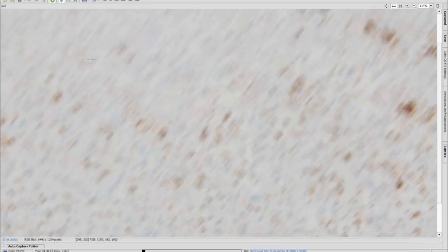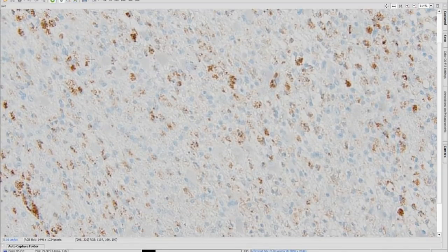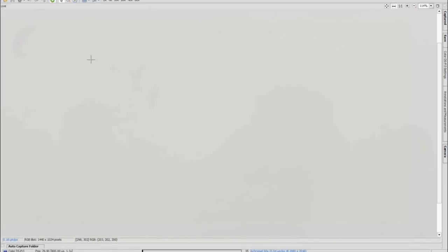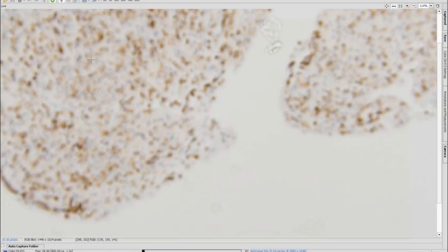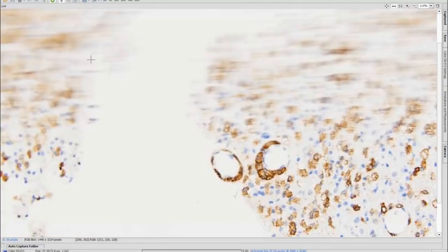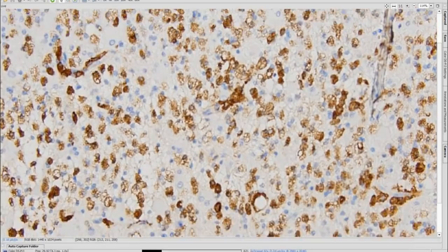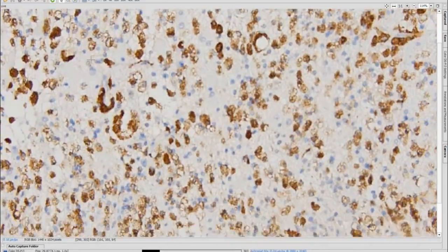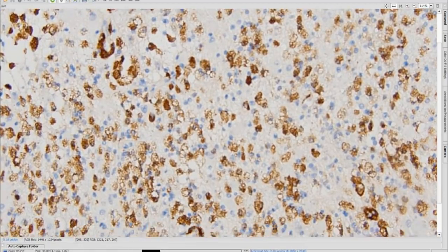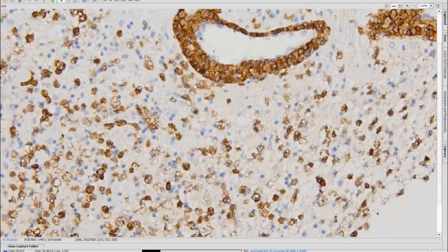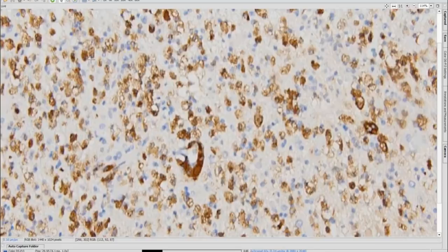You can see accentuation of CD68 around perivascular areas and also diffuse infiltration of other areas. CD68 is not 100% specific — it's a marker of lysosomes — so sometimes tumors with increased lysosome content, including gliomas, can be CD68 positive. A more specific macrophage stain is CD163, which we have here. It is also positive and actually a little stronger than CD68 in many instances. When you have a dense infiltrate like this of macrophages and someone is pressing you toward a tumor diagnosis, you really have to seriously consider the possibility of something non-neoplastic.